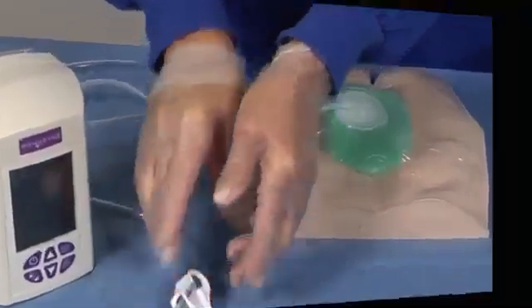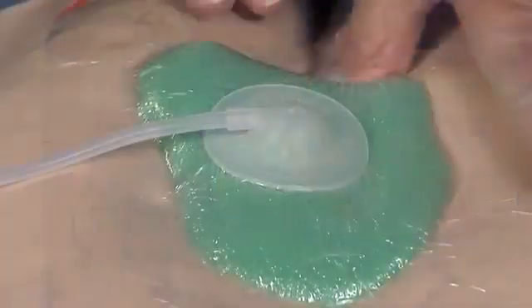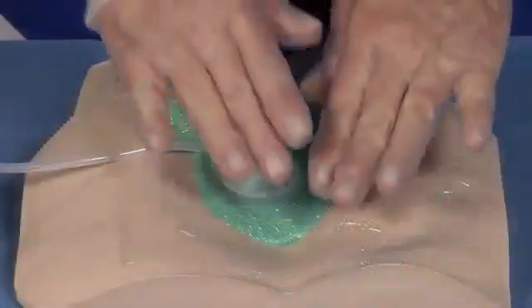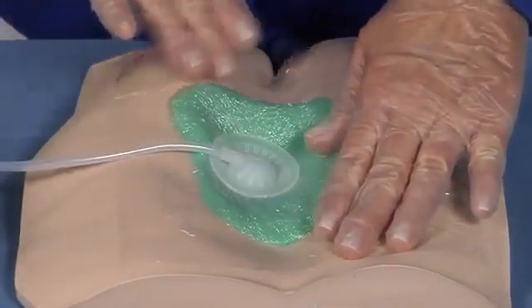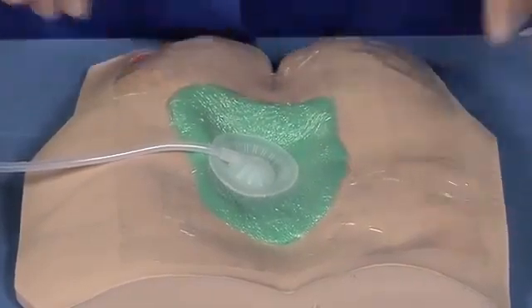Ensure all clamps are open. Turn the pump on and observe the ease in the drawdown. Gently run your fingers around the edges to ensure the seal is secure. Remember not to apply the port dressing over a pressure area. A bridging or relocation technique can be used in these situations.